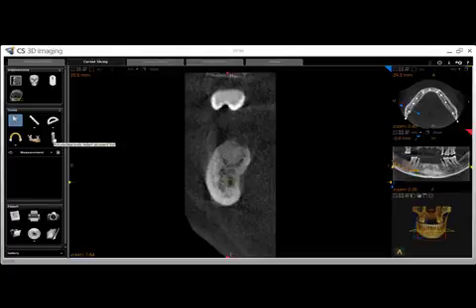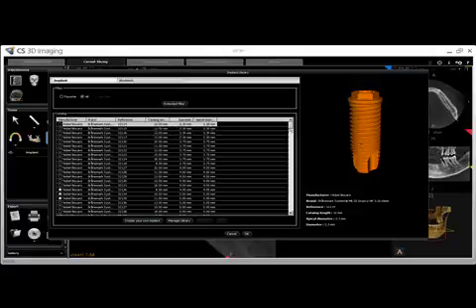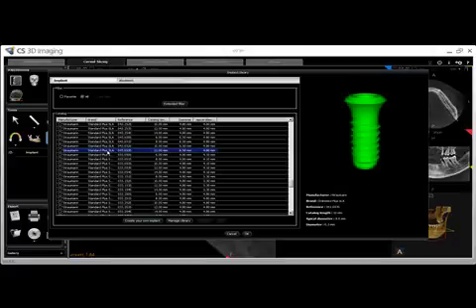To place an implant, click the implant placement tool. This will open the implant library. Each implant in the library shows a description of the implant as well as the dimensions. Scroll through the implant library until you find the fixture you would like to place. Single-click to highlight the implant and then click OK.